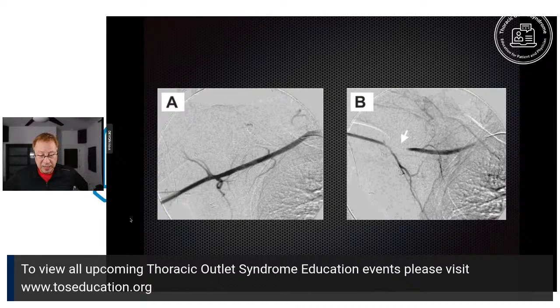You'll also notice that to get the big picture of the artery, you have to kind of erase the bones. So really, you're getting as pure a picture of the artery as you can. But that means you cannot easily assess what other structures are pressing on that artery. Now, in some cases it's obvious. You don't really need to see them. But in many cases, because of the complexity of the thoracic outlet, you want to see what exactly is pressing on that artery.